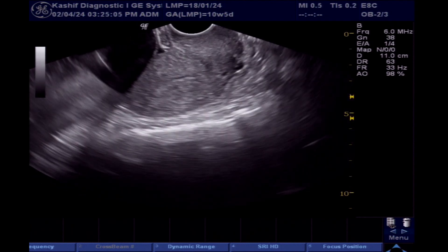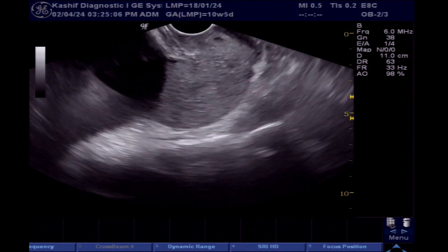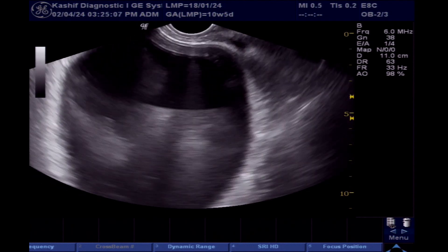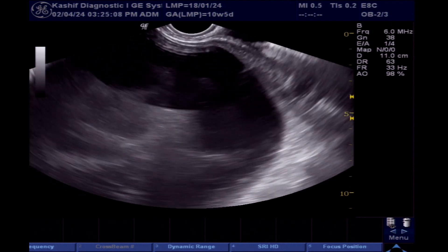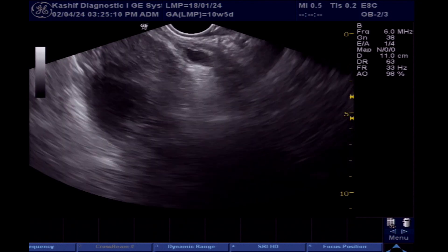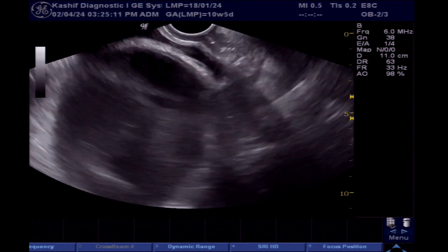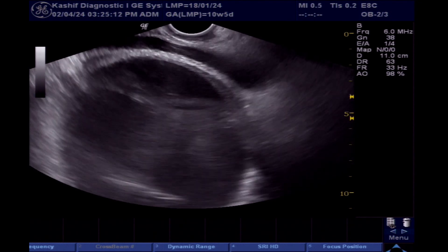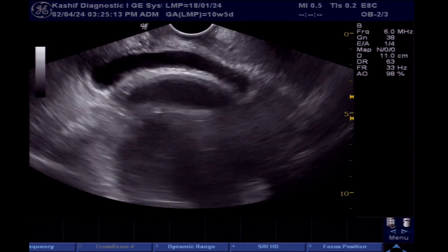TVS ultrasound is done. However, TVS ultrasound does not give much information, as the cyst is large and huge and out of the field of view of the TVS probe.